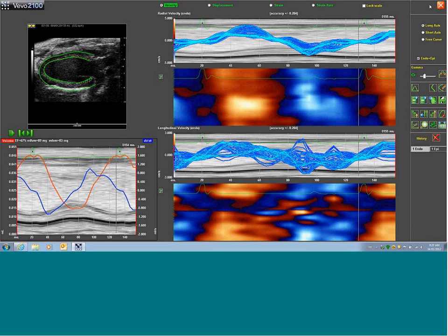Okay, there's one other question here. Why would someone use time to peak analysis rather than the standard analysis screen? You went through both of those methods, so what would be the motivation to choose one or the other? Sure. The standard analysis will give you an overall picture and information about the myocardial function. But what time to peak gives you is information about the synchronicity of various regions of the myocardium. Okay.